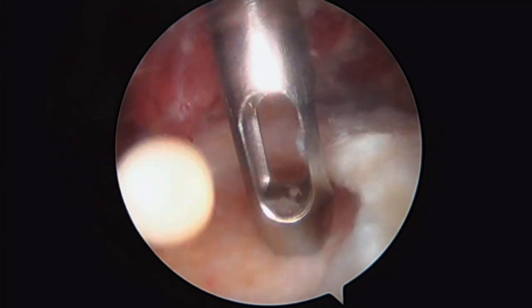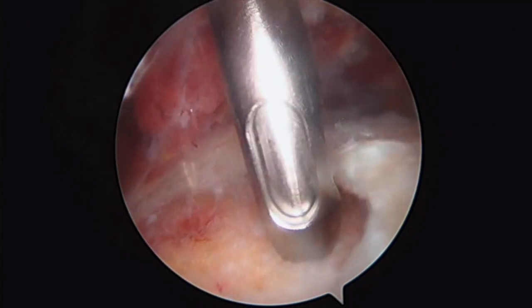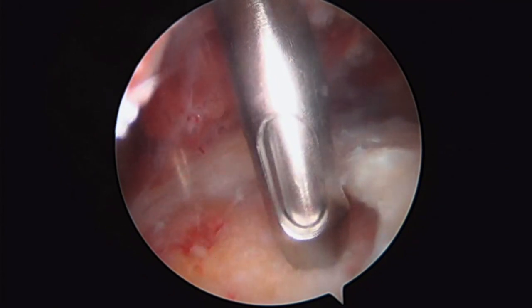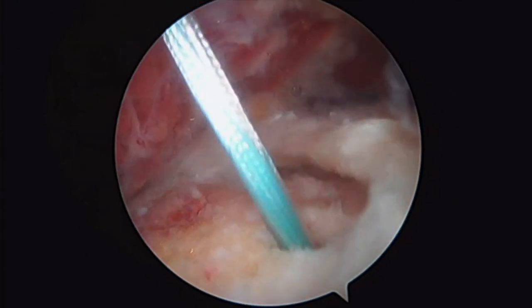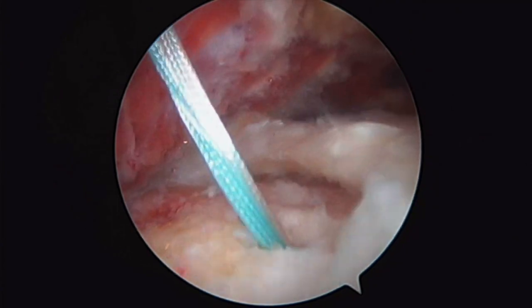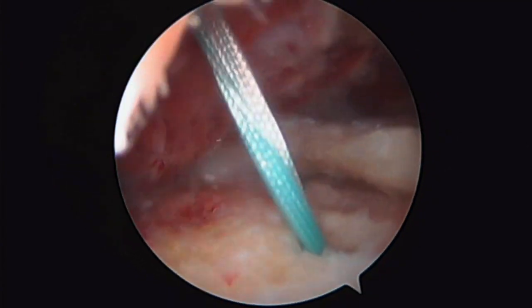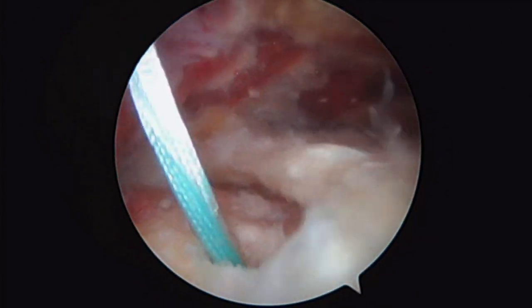The cool thing about this anchor is that it's all suture — there's not actually a screw associated with it. It's just the suture material that creates the anchor. There it is going in. There's a look at our anchor — it's double loaded with two number two ultra braid suture. I'm really pulling on that just to show you how firmly set it is in the tuberosity of the humerus.